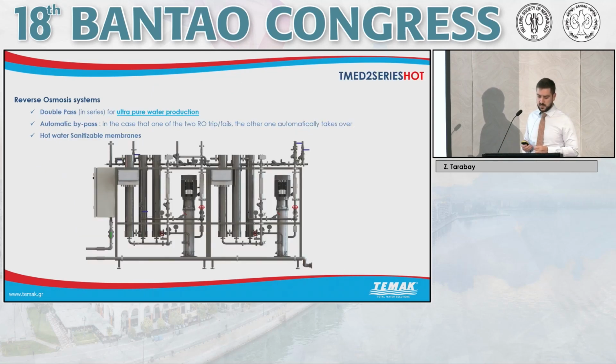The reverse osmosis system itself. It's a double pass in series operation, so of course when both are operating, you are producing ultra pure water. It's got what we mentioned before, the automatic bypass, so in case that one of the two RO fails, the other one automatically takes over and supplies the water to the distribution ring. We have hot sanitizable membranes.